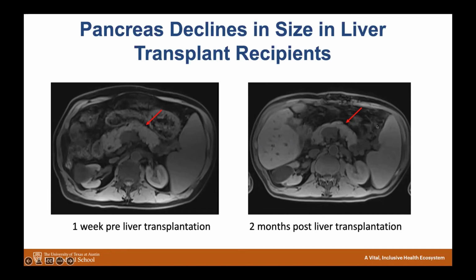And we've tried to capture the same kind of axial slice here. You can see the spleen and kidney look similar. Granted, you have this liver transplantation in here as well, so these abdominal organs may have shifted a little, but we can again go through all these different slices and quantify how big the pancreas is.